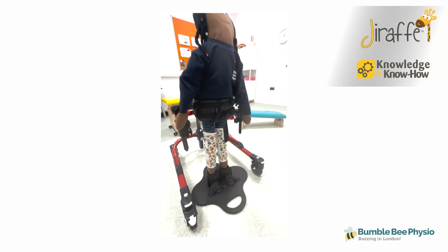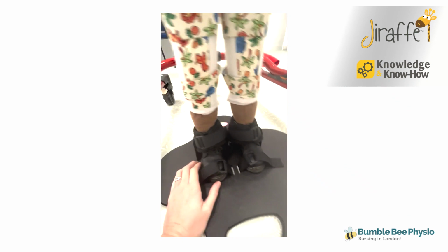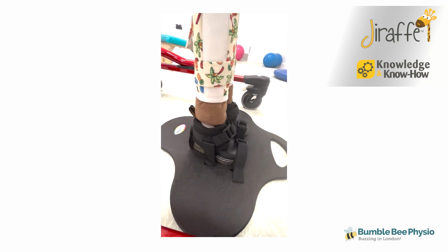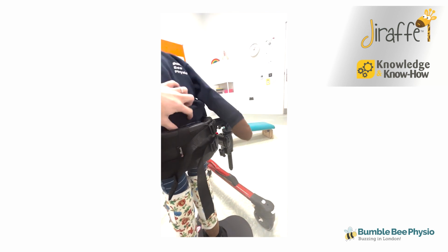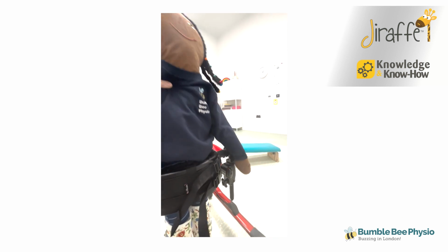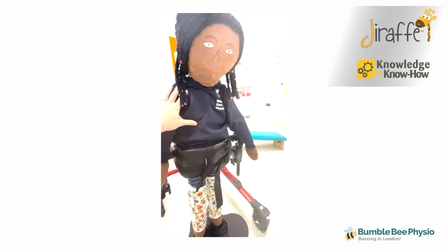So for the hamstring stretch, again, we have the feet very secure onto the shore stand with all of these straps, making sure that we have full foot contact. We have the gaiters on, and then this support here is all the way down to the hip crease. So we've got the hip crease right here, and this means that hip flexion is enabled. So she can come down, reach for toys, and stretch back up again, getting that targeted stretch to the back of the hamstrings.